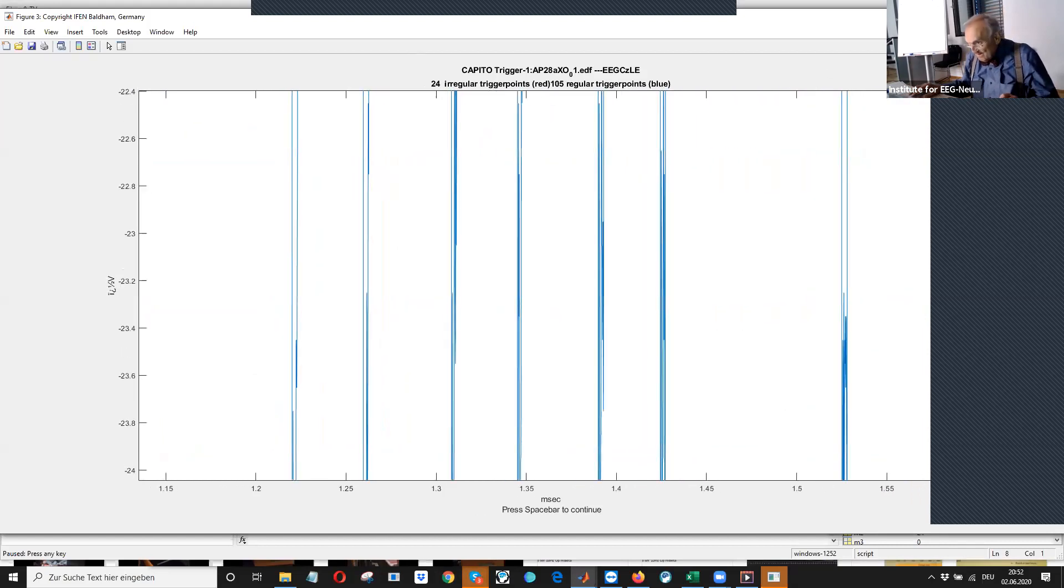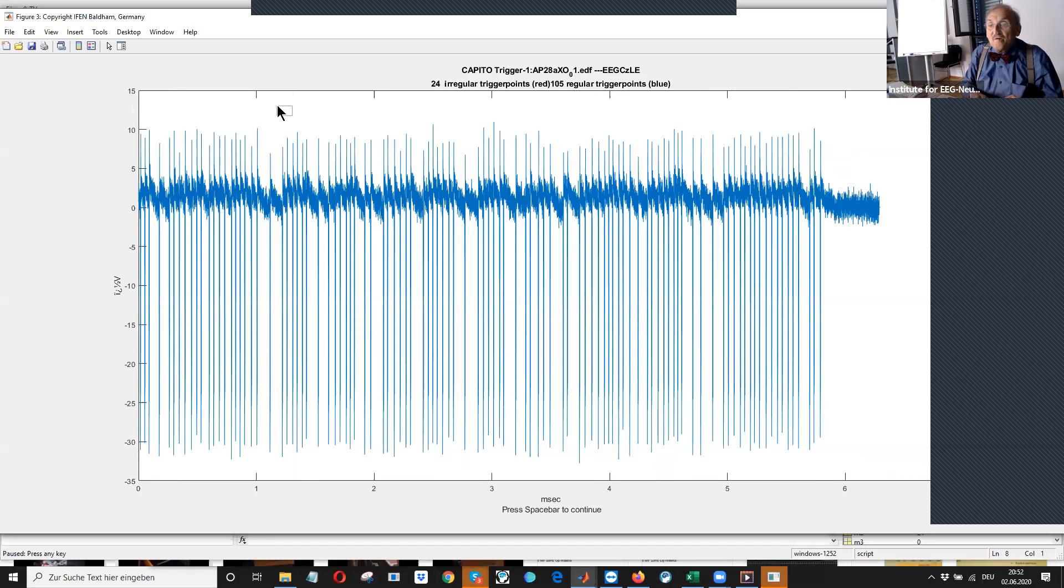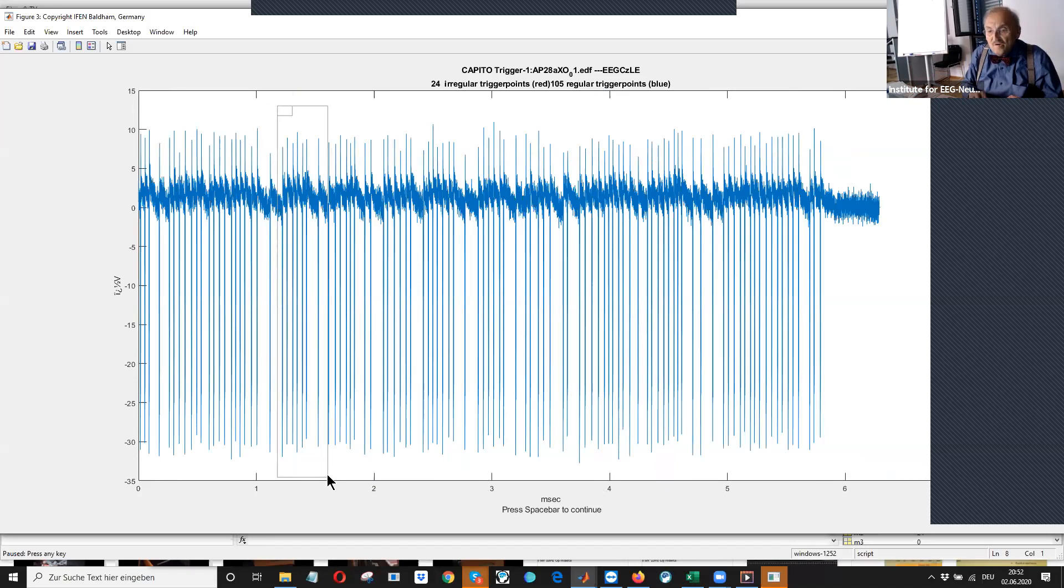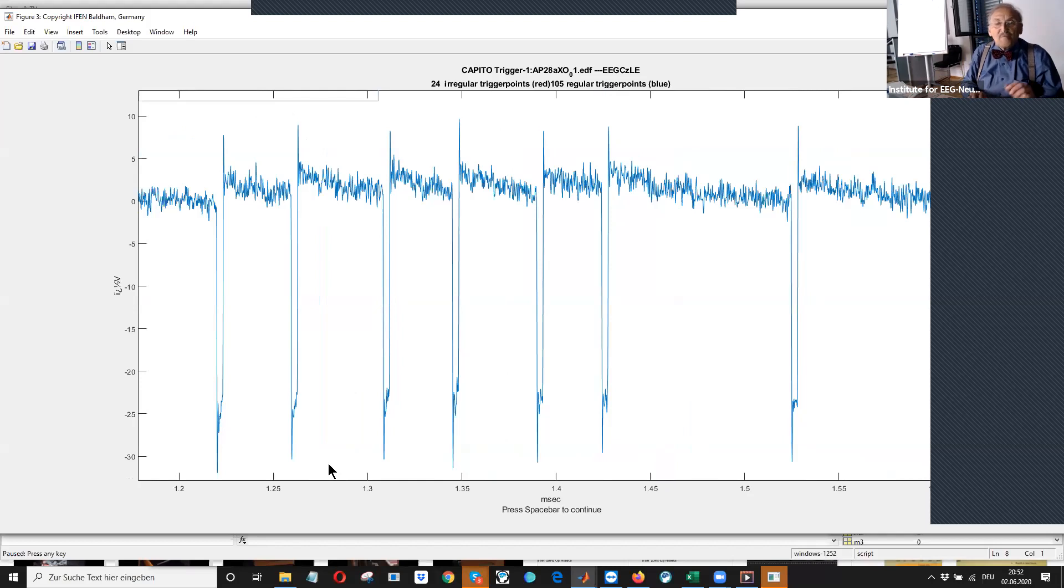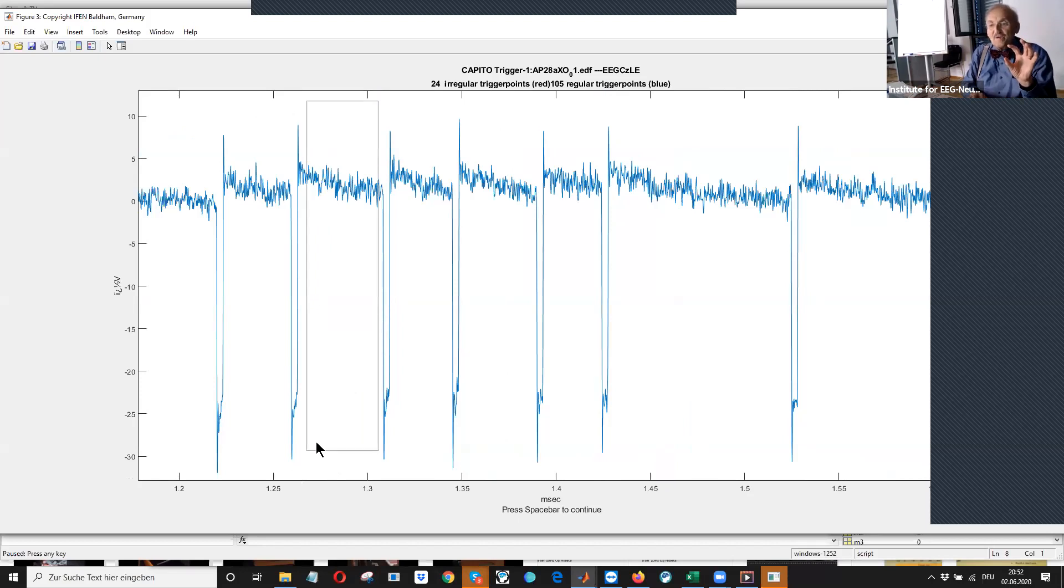Oh, I have to do it once more. I better work with this one. These are the triggers which are provided by CAPITO each time when an X was provided on the screen.